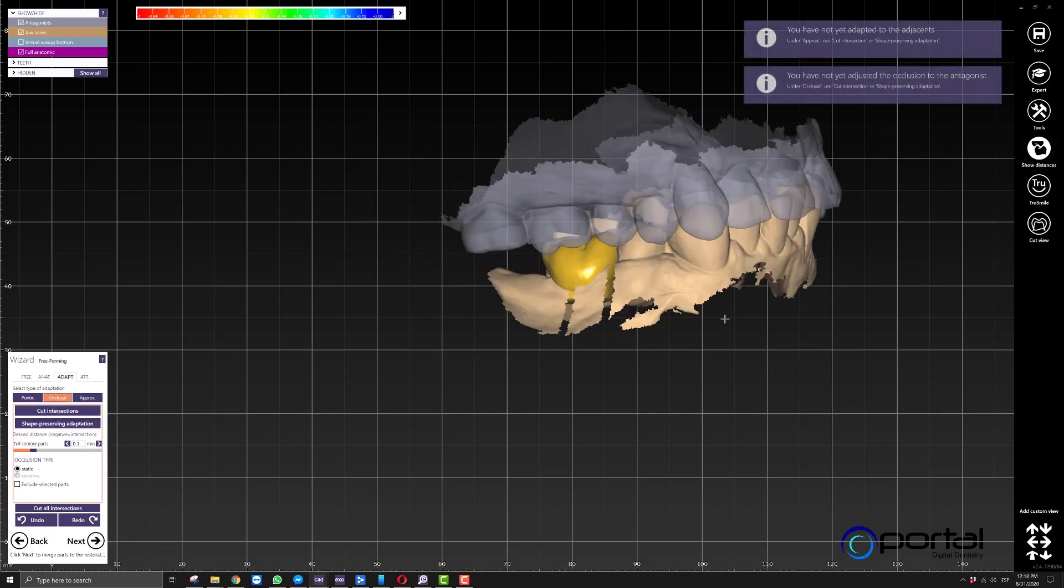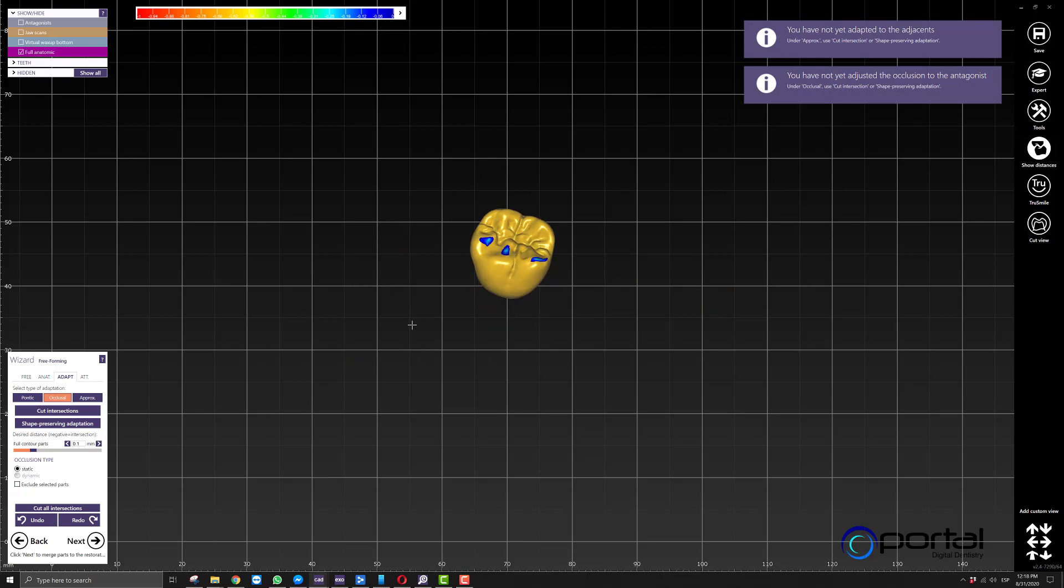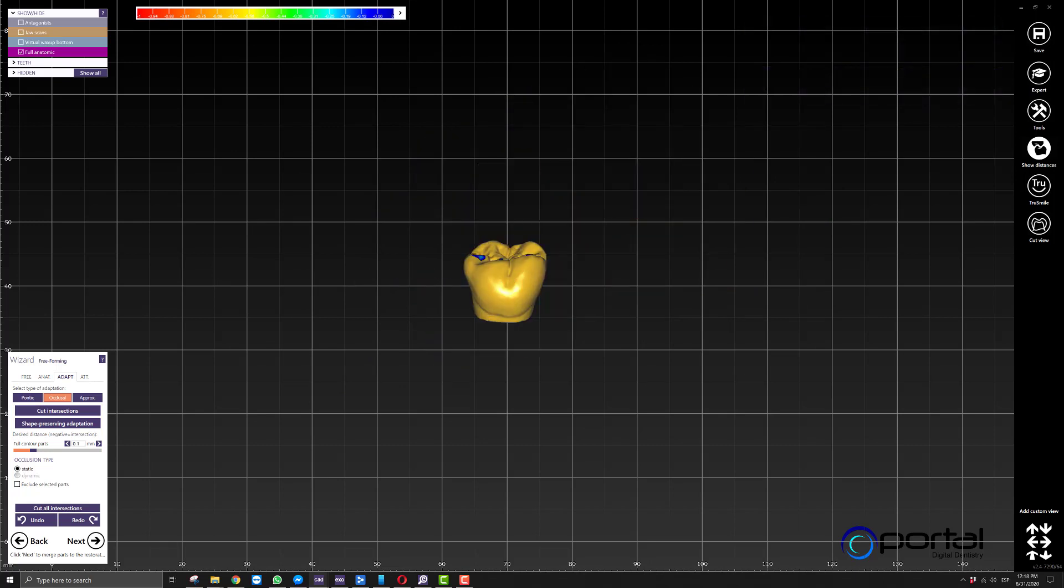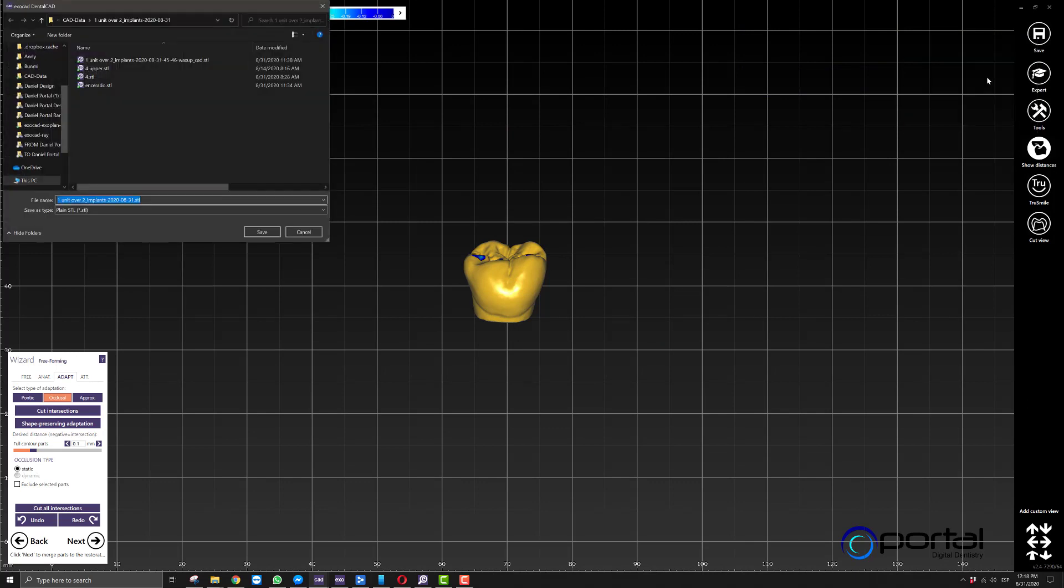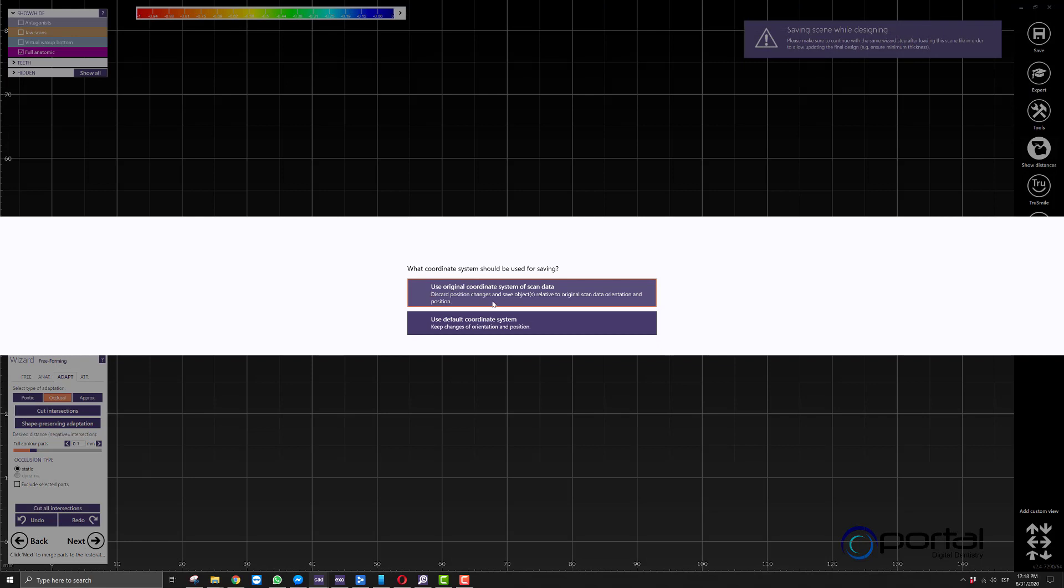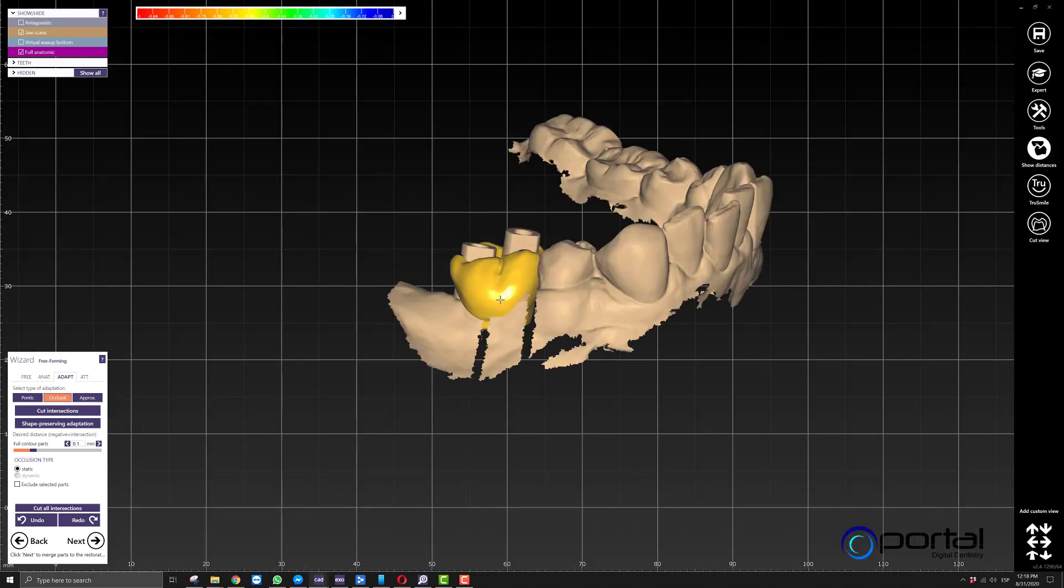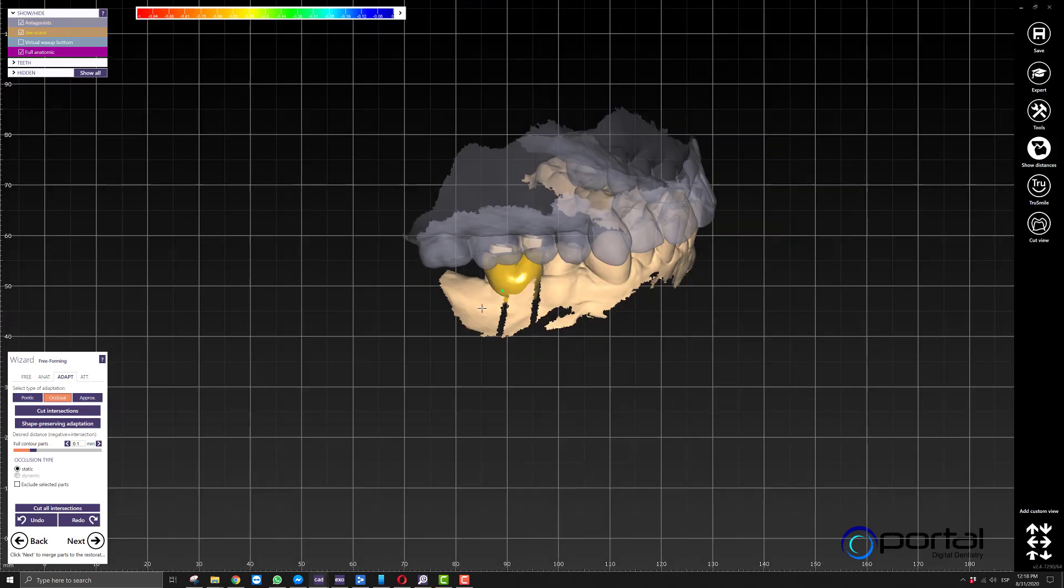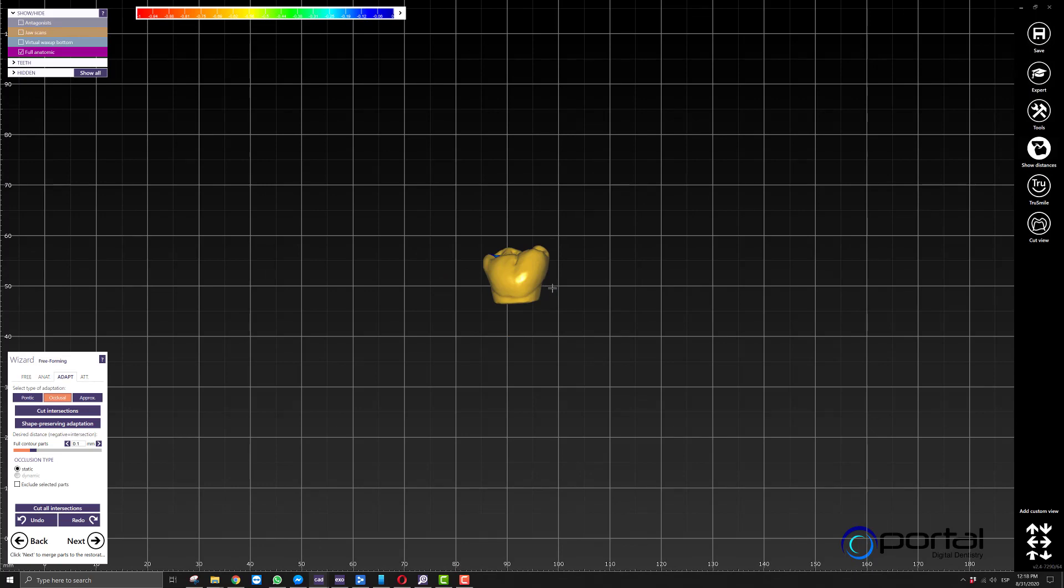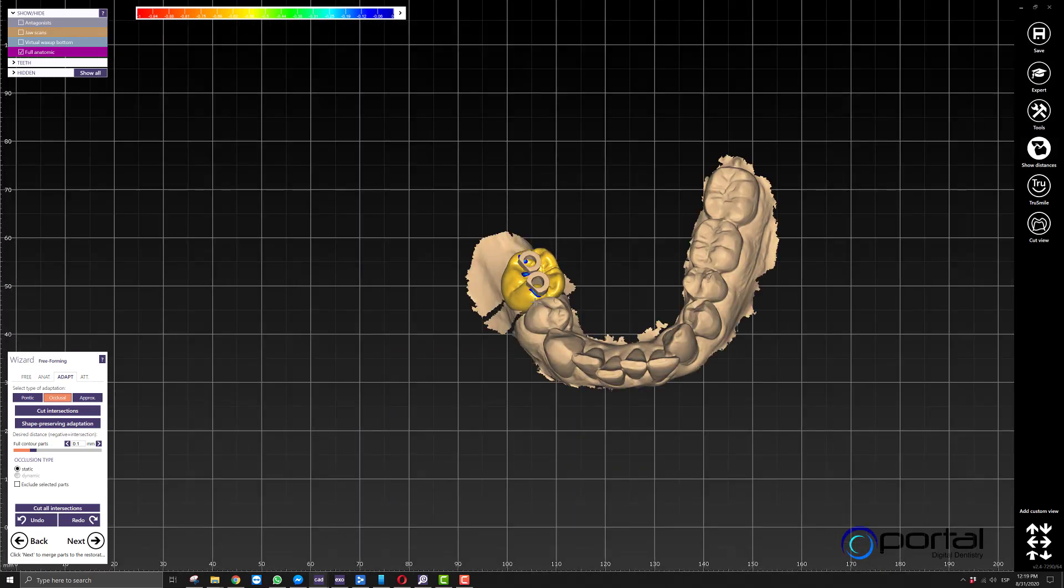At this point, we're going to isolate our pontic and export it as a mesh. You can call it whatever you want—I'll call it wax up. Make sure you always use the original coordinate system of scan data. The reason being, if you use this, it'll be saved in the same position in relationship to the rest of the files. So now we have all the information we need: our final product, our working model, and our antagonist.